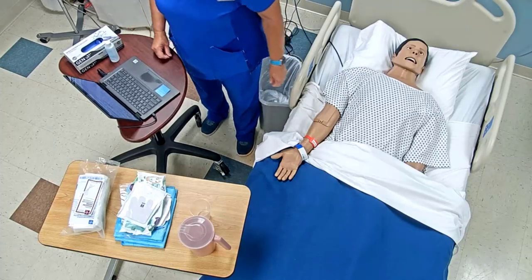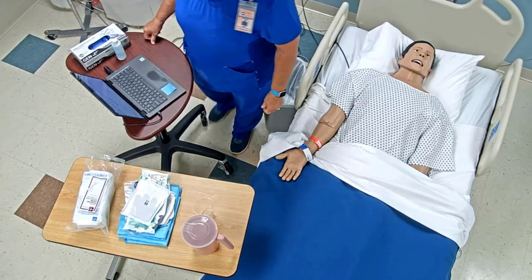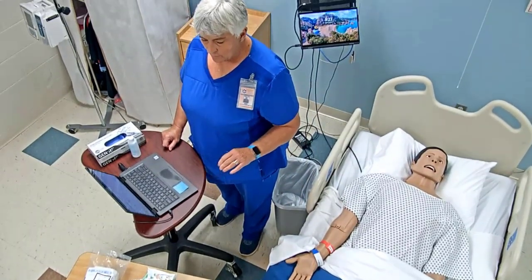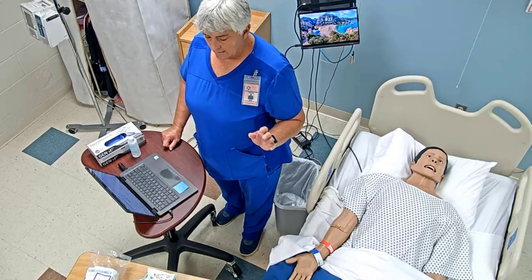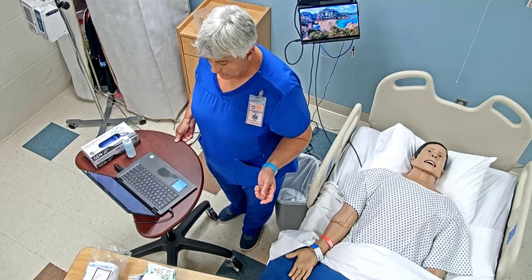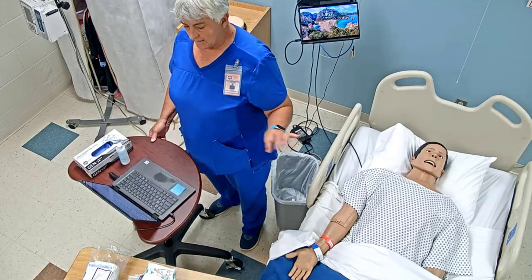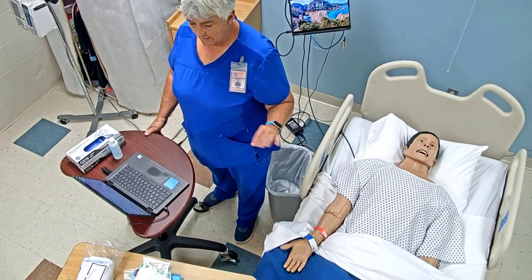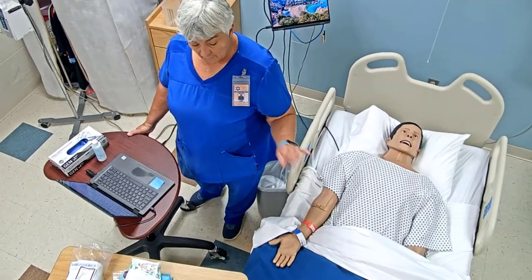Okay, this morning we're going to be demonstrating how to do a straight catheter. On the Foley catheter, we did that on a female, and the straight catheter we're going to be demonstrating on a male this morning. But as far as the technique, putting the catheter in a female would be the same as it would be on the Foley catheter.